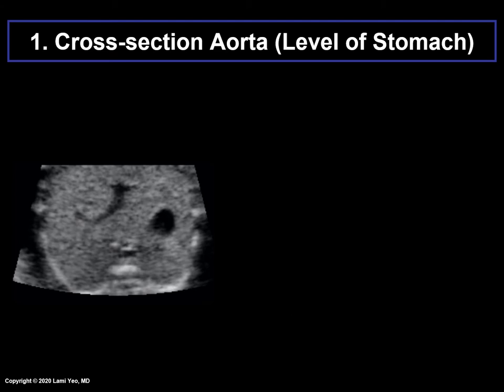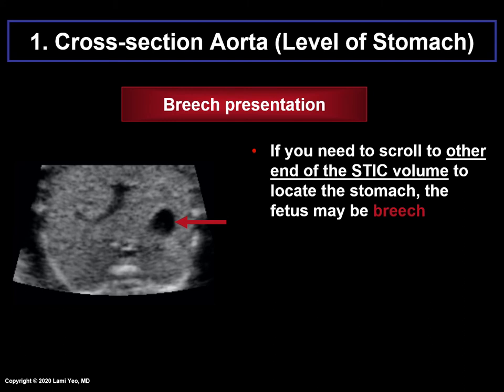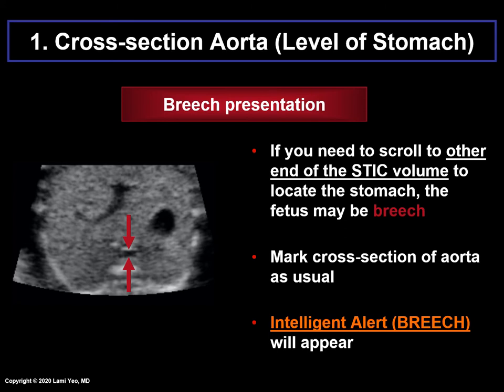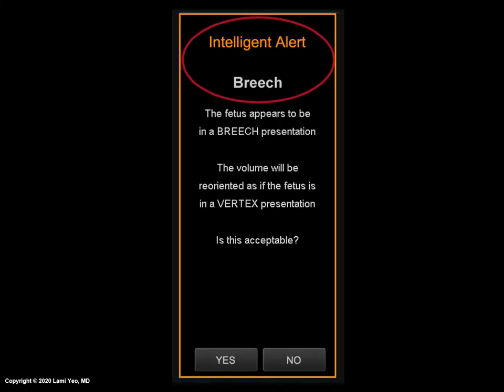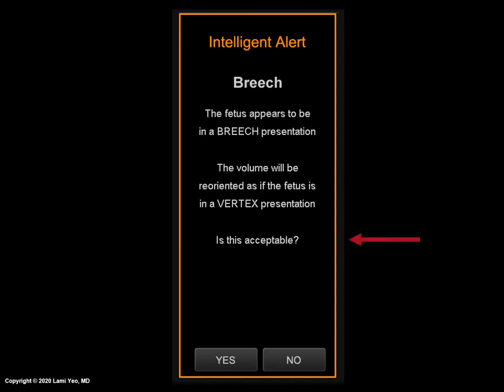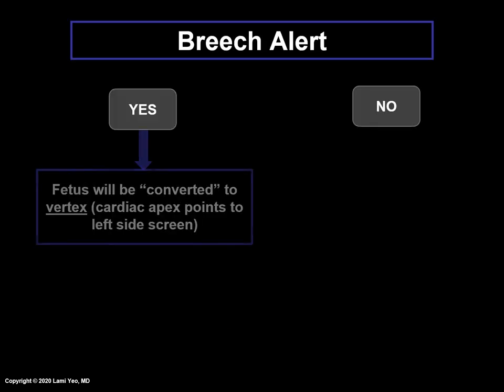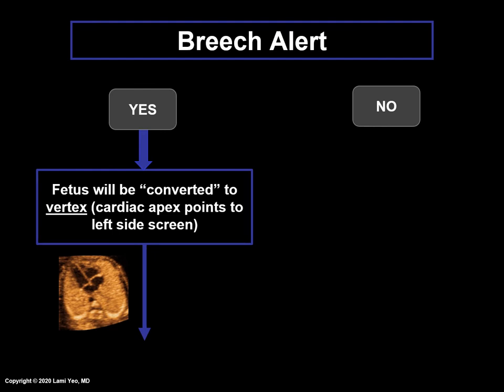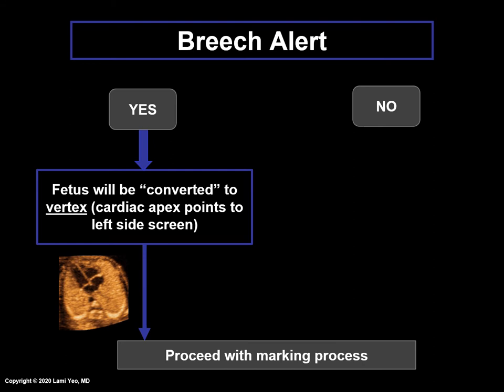Occasionally, you may need to scroll to the other end of the STIC volume to locate the stomach — this may mean the fetus is breech. Go ahead and mark the cross section of the aorta as usual, and then an intelligent alert known as a breech alert will appear. The breech alert states that the fetus appears to be in a breech presentation and that the volume will be reoriented as if the fetus is in a vertex presentation. The user must click yes or no. If yes, FINE will automatically convert the fetus to a vertex presentation so that the cardiac apex points to the left side of the screen, and the marking process continues as usual.